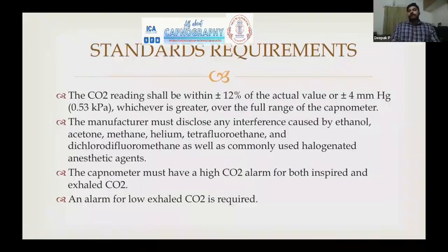Several international and US guidelines have set certain standard requirements. That is, the carbon dioxide reading shall be within 12% of the actual value. The manufacturer should disclose any interference caused by other chemicals. It should have a high carbon dioxide alarm and a low carbon dioxide alarm.